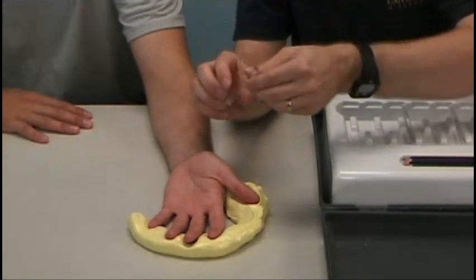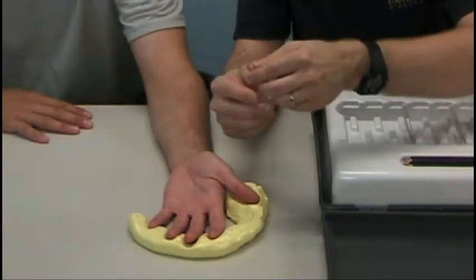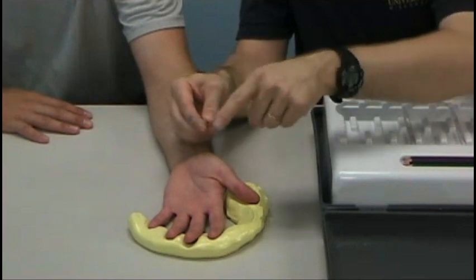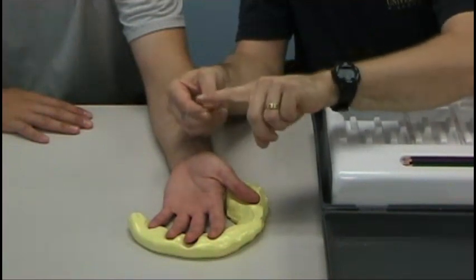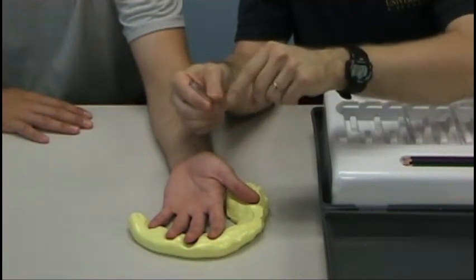The monofilaments consist of a little plastic bar, and at the end of the bar is this little filament. It's kind of like a fishing line.